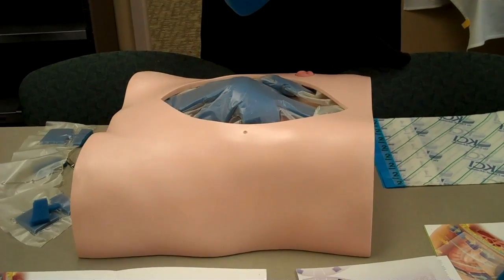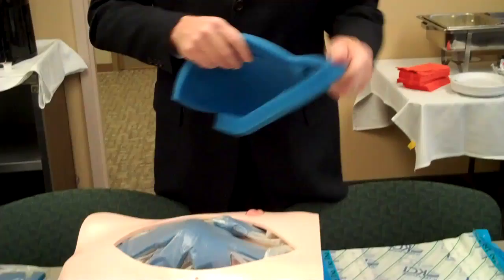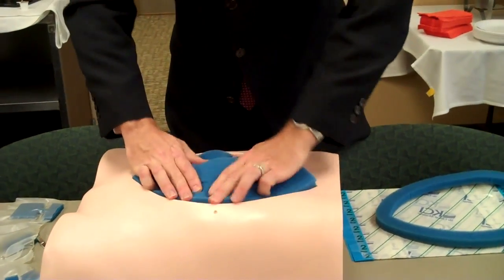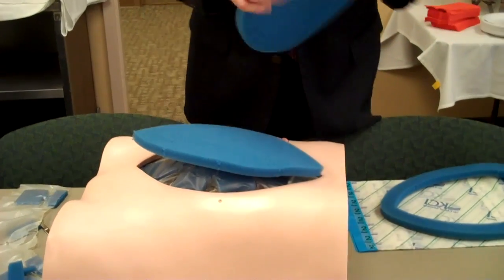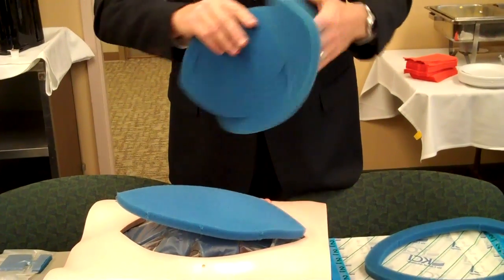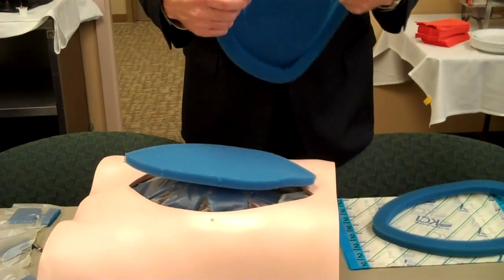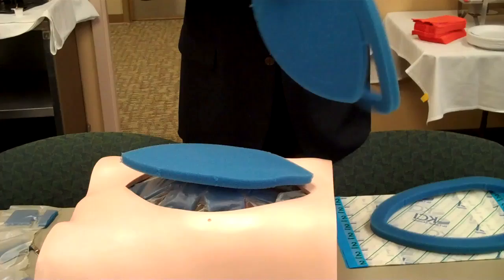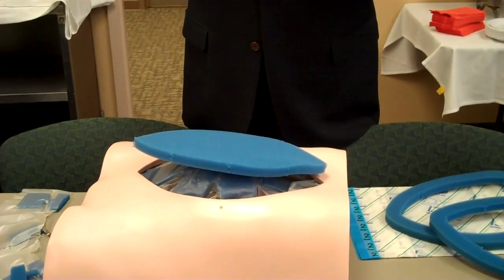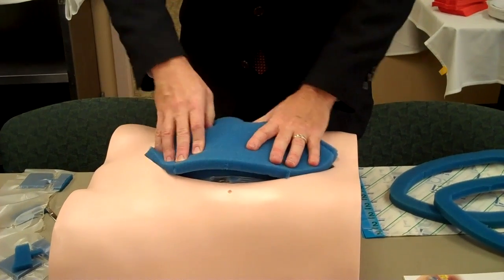In my opinion, you should use both layers of granule foam, not just one. Depending on the size of the laparotomy incision, you can remove one, two, or three pieces of foam and fit this over the visceral protective layer. The reason I like this overall is because this granule foam does a good job of making sure that the health of your laparotomy margin continues to be nice and healthy. So when you do get fascial re-approximation and want to re-approximate the skin, you've got good granulation tissue that's going to come together for the closure of the patient's abdomen.